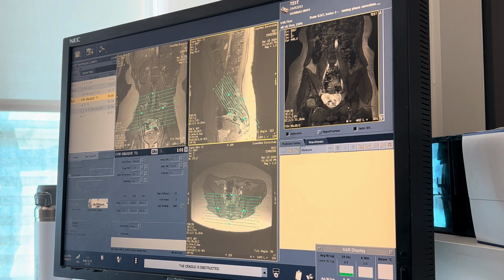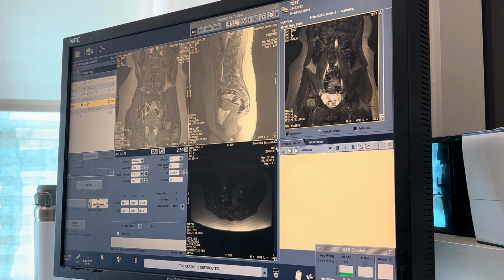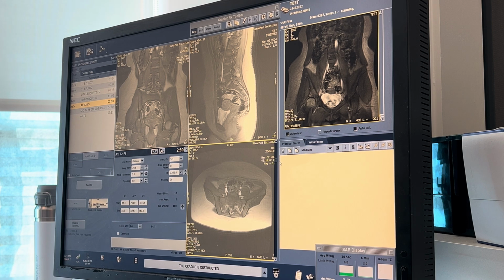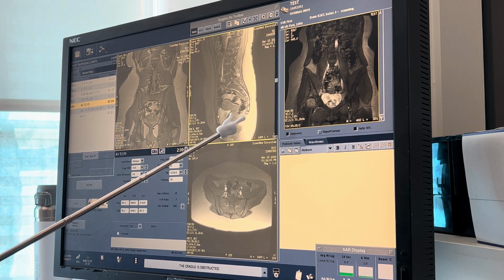Let's go into the axial T2 fat sat. You always want to be ahead. And SI joints, sacrum, coccyx, because you have to oblique everything, I plan everything from the localizers because those are true axial, sagittal, and coronals. So let's find our money slices again. If that's not the one already. Yeah, one more. I think it was either this one or the one above it. Okay. Alright, so doesn't matter, it's all pretty good. So now let's go up one more. There you go, that's the one we used, and this is that money slice for the sacrum coccyx. You can see the coccyx very well here.